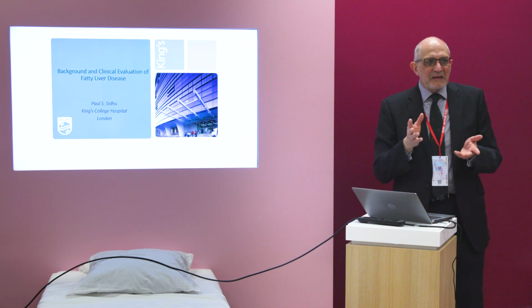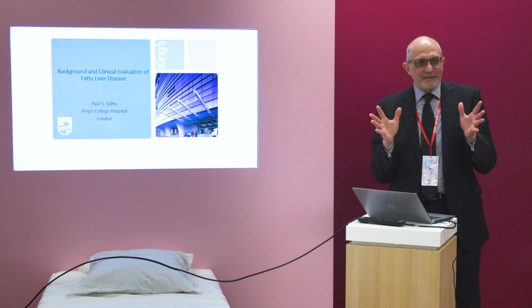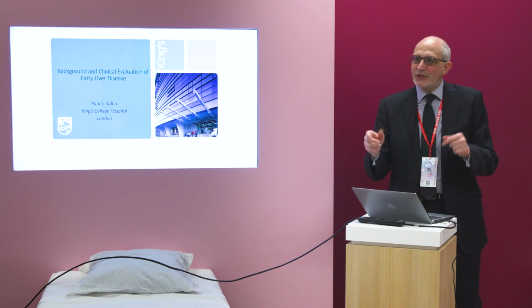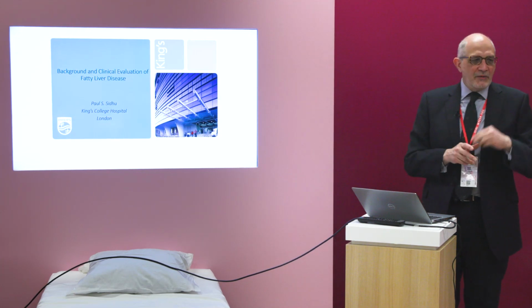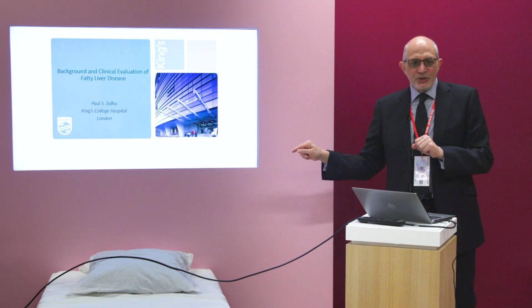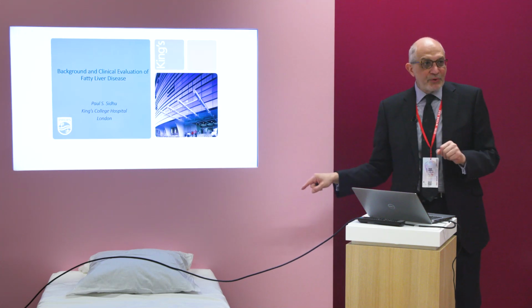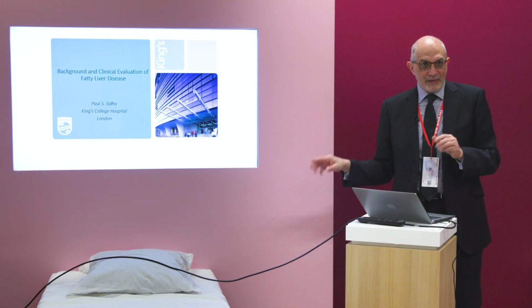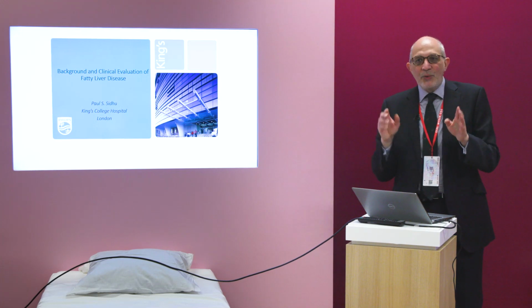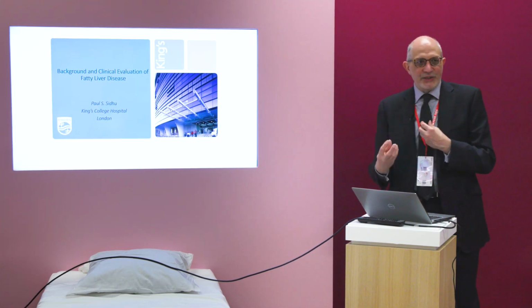Then they come back, and it's moderate or severe now, what shall I tell him? You want something objective. You want to be able to say to the patient, you've come to see me, the fat was this much, and now you've come back and the physician has treated you, encouraged you, and it's there. So you're now improving your lifestyle, etc. So that's one thing. You want some sort of figure that the physician understands and the patient understands.